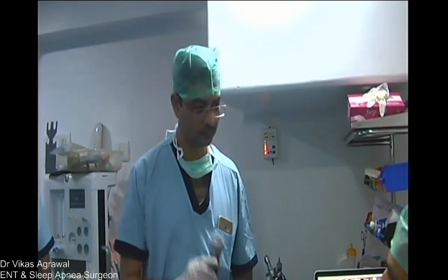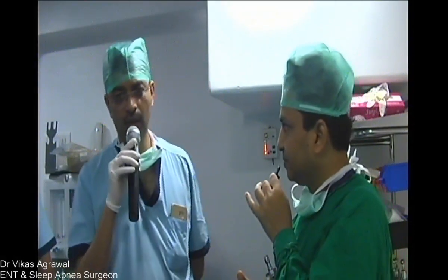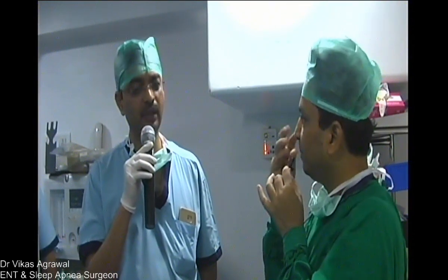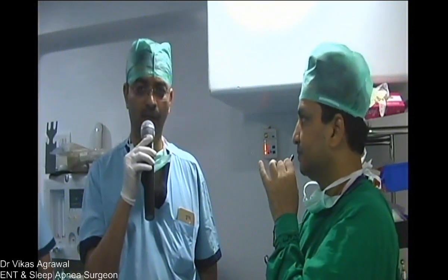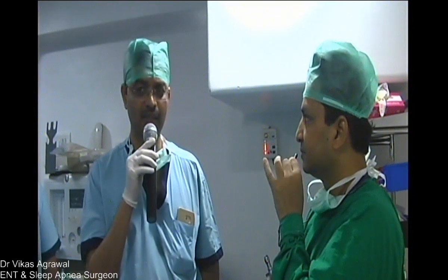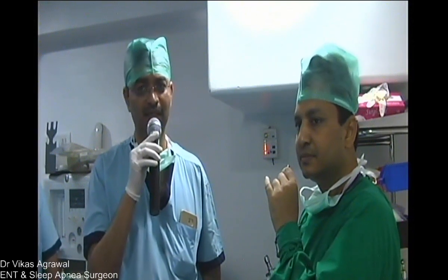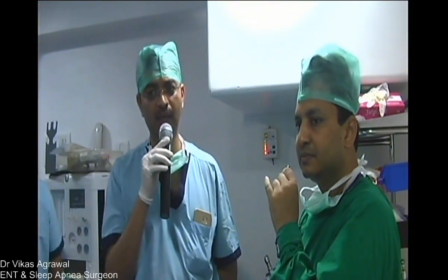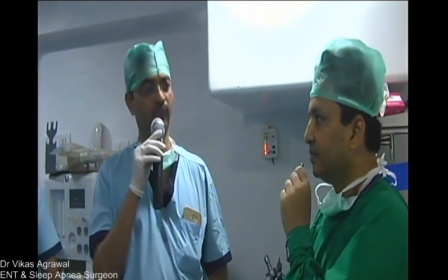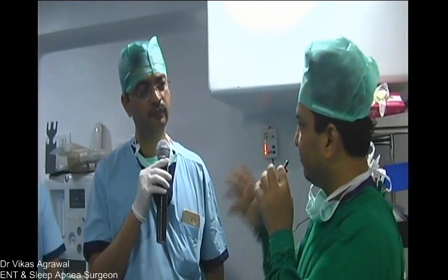Okay, Kalpesh, how confident are you that you'll be able to ventilate this patient with LMA? With practice, and now that I have seen the patient clinically, the clinical mouth parameters, yeah, mouth opening is good. The thyromental distance is good. The neck mobility is good. These are the three factors which are very important to understand for putting the LMA in the patient. And in these situations, if the inside anatomy is not distorted, LMAs are generally made in such a way that they fit very well around the glottis, around the vocal cords, and give good ventilation.